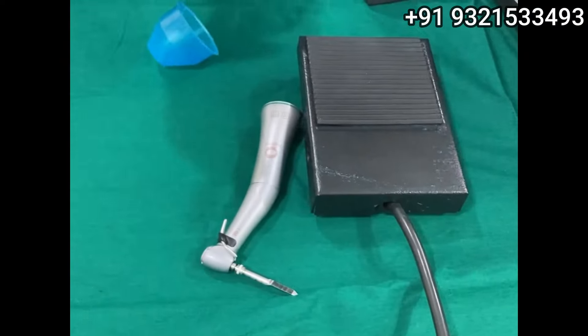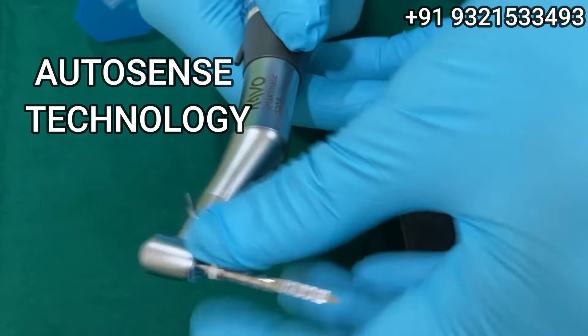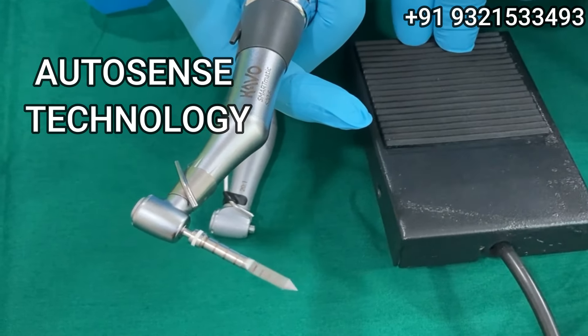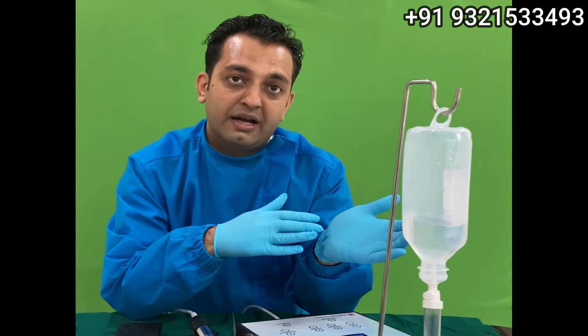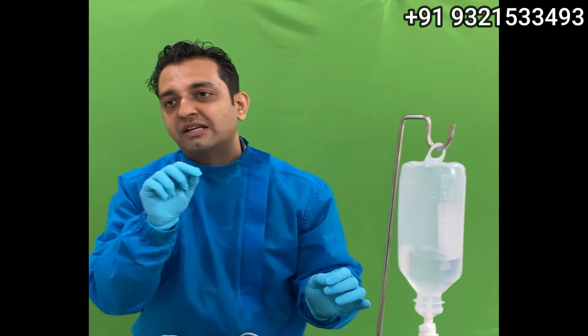But if I remove this handpiece and change to the 1:1 handpiece — I have not changed the program, only the handpiece — the machine auto-detects that this is now a 1:1 handpiece and gives 24,000 RPM. So in P3 mode, you see two readings: 1200 and 24,000. If you put in the 20:1 handpiece it auto-senses and gives 1200 RPM; if you put in the 1:1 handpiece used for basal implantology, you get 24,000 RPM. The machine is auto-detecting — you don't have to do anything.